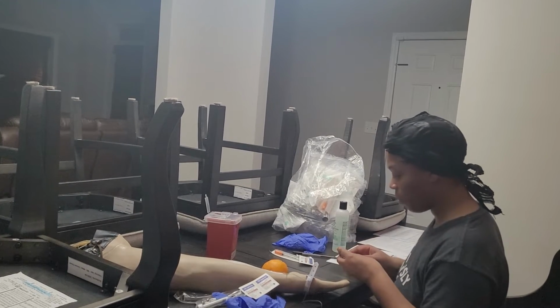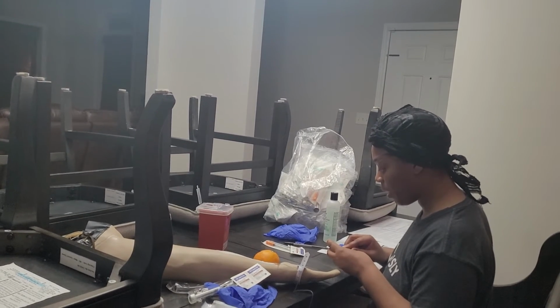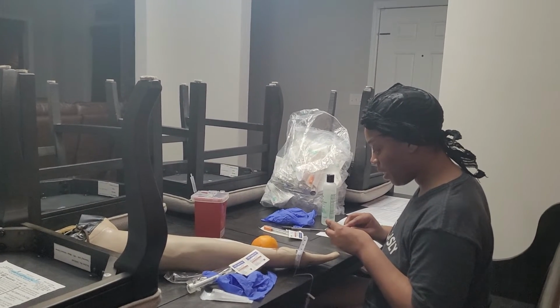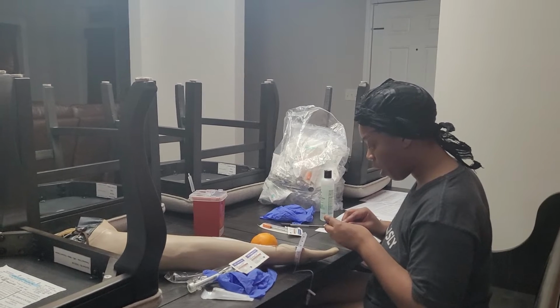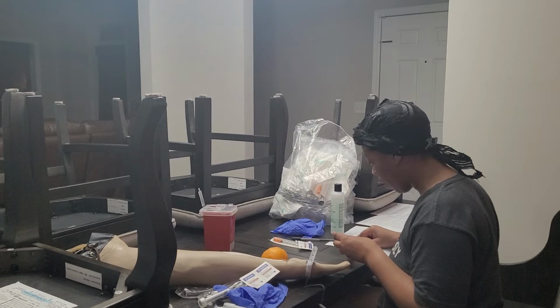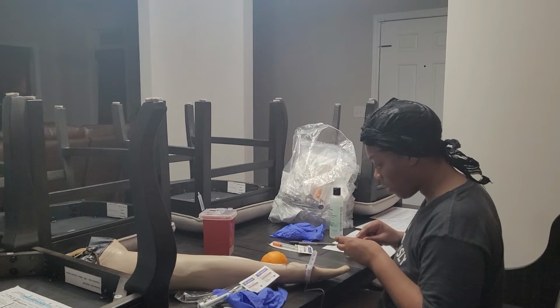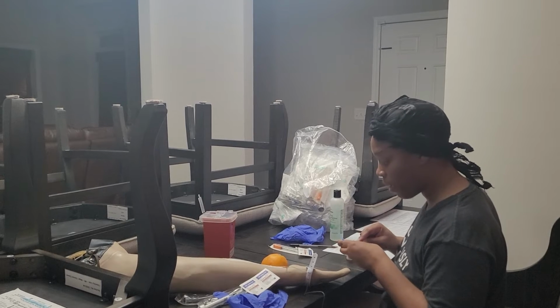And I'm just going to double check again. I have them out of the drawer, so now I'm just going to double check them again. Furosemide, 10 milligrams per ml. My order is for 20 milligrams IV push. And so that means I'm going to administer 2 mLs.